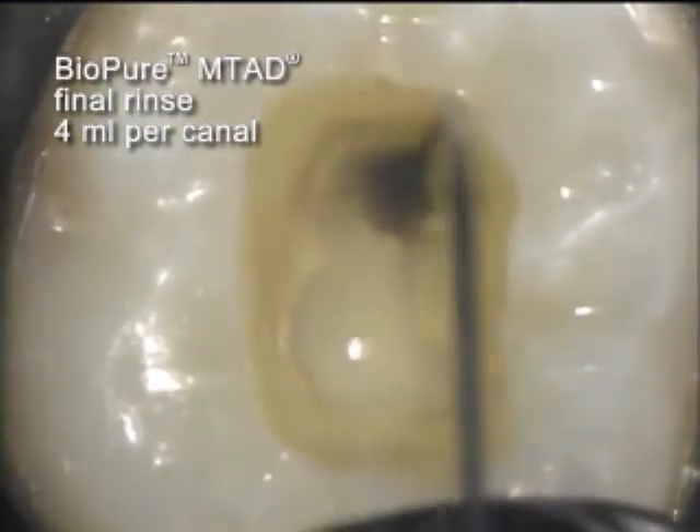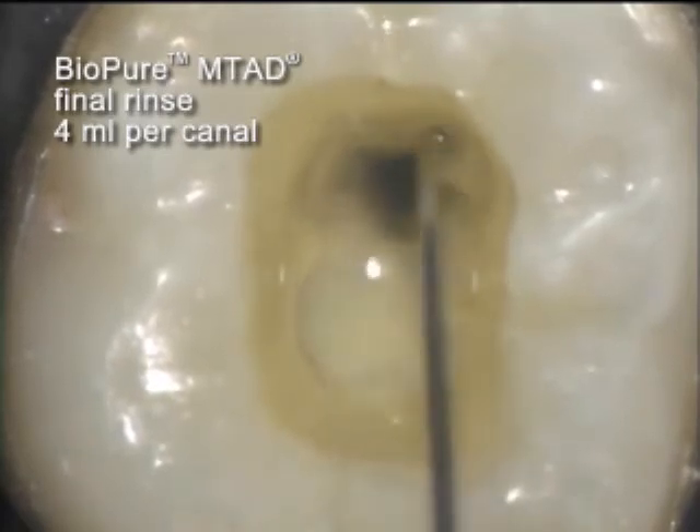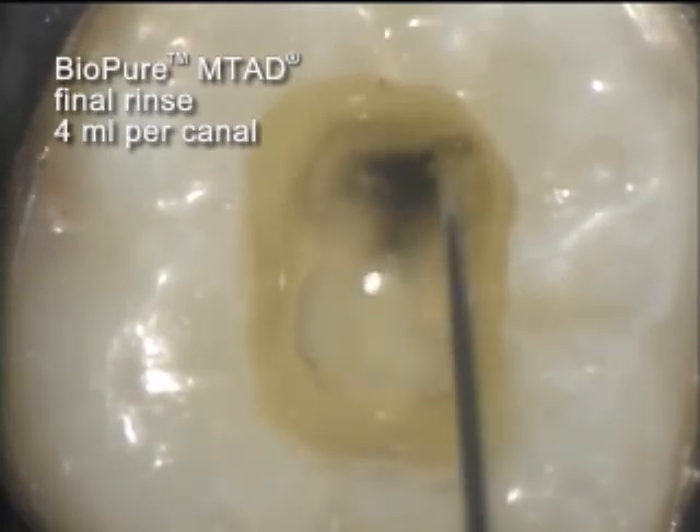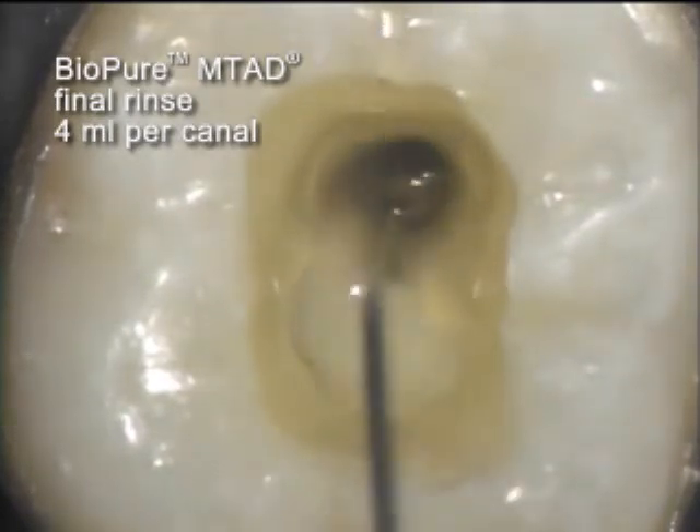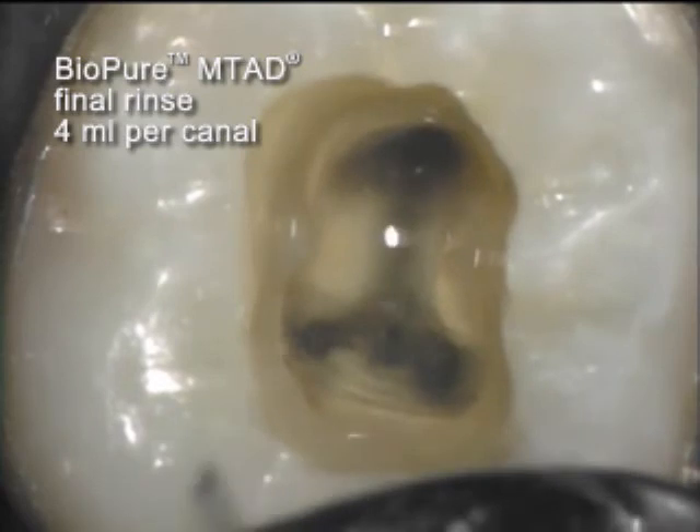Another visible reaction is observed when the fresh solution is introduced. This reaction diminishes as more solution is flushed through the canal space.